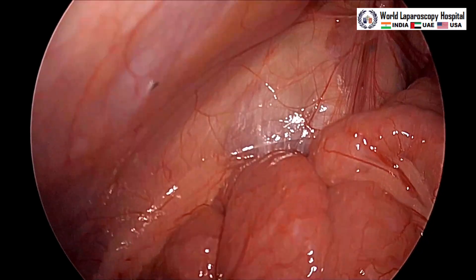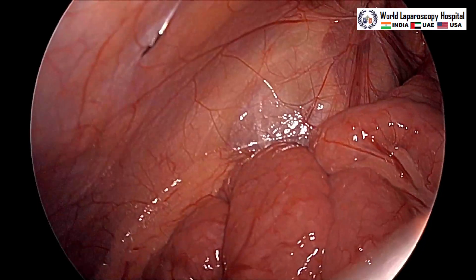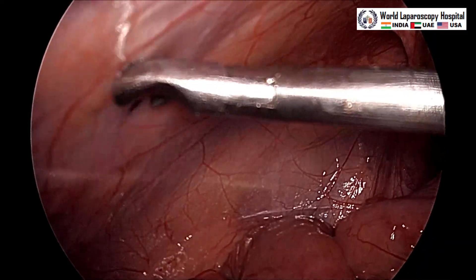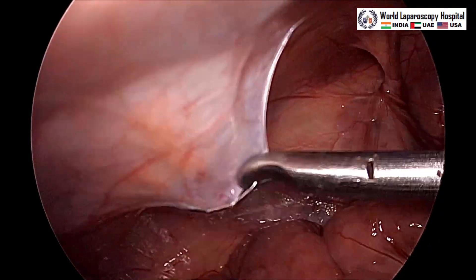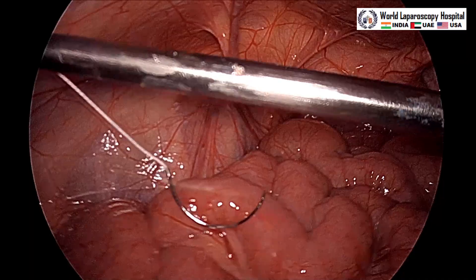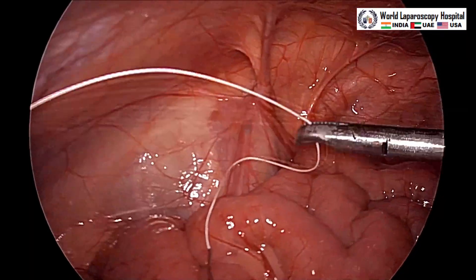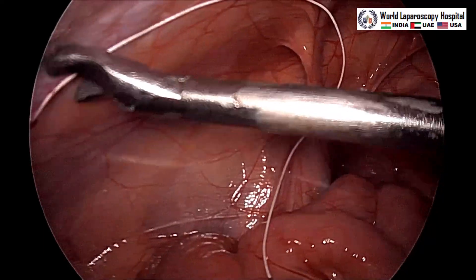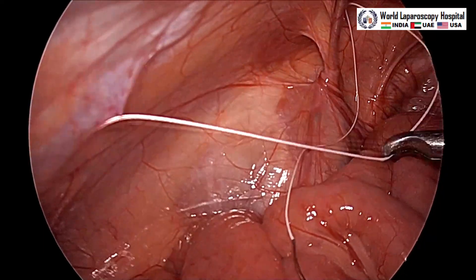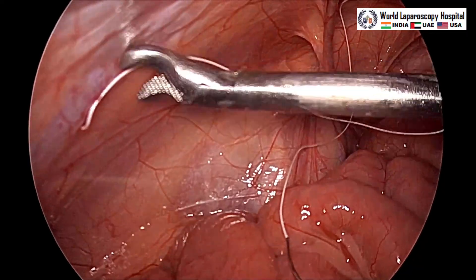Now the needle will be introduced percutaneously. In pediatric patients it is very easy to introduce the needle by just pricking from the anterior abdominal wall. With the needle holder we can pull. We are using Ethibond that is 2-0 with a 24 mm curved needle, round body, and suture length is 20 centimeters.